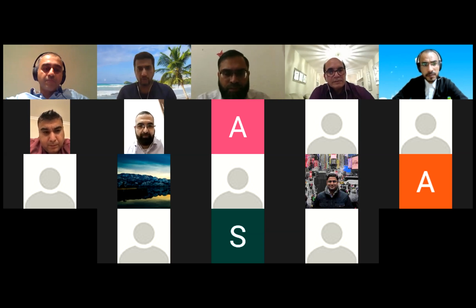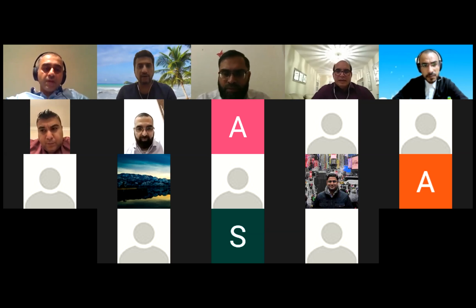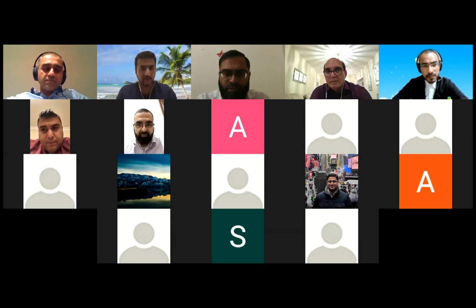So coming back to this poll, two people think intravascular imaging should be used in selective cases, but other people say it should routinely be used. The guy I trained with used to say you should use it all the time, even if you do it at the end, not necessarily at the start, but at least at some stage you should do it. I have to say I've never regretted using intravascular imaging. I've yet to do a case where I've regretted pulling out my OCT or IVUS catheter.